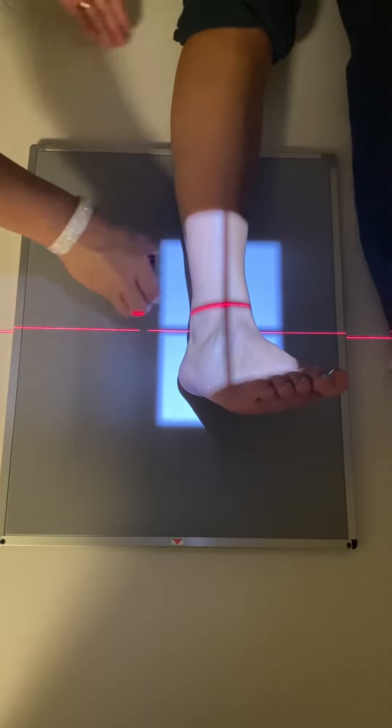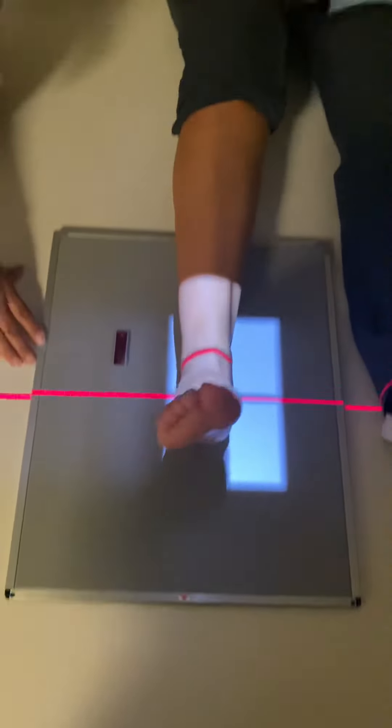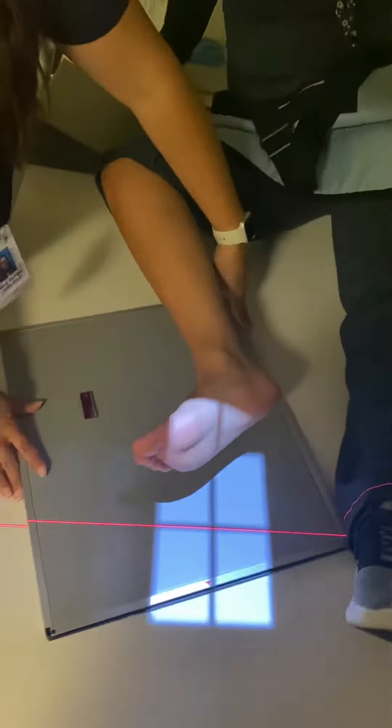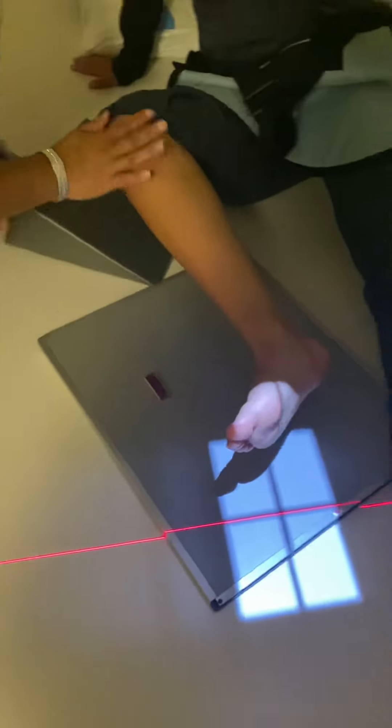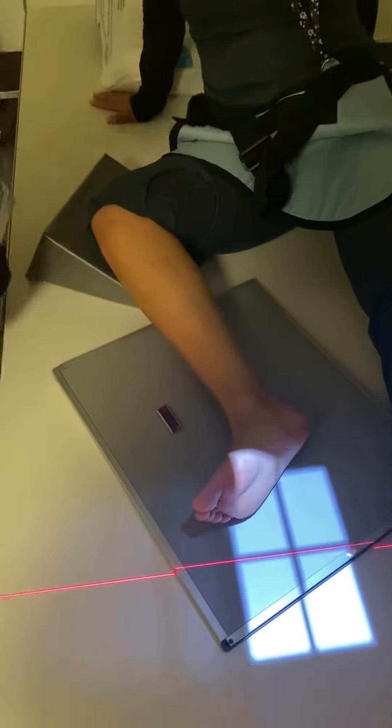Then for the lateral view, you're going to have your patient bend your knee up and then roll your leg out to the side towards me. I'm going to put a sponge underneath the knee again so that they don't over-rotate.